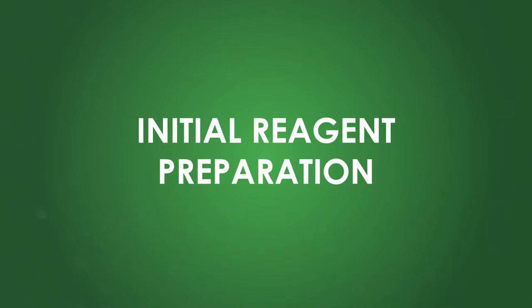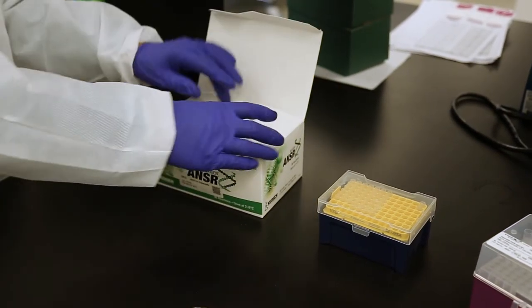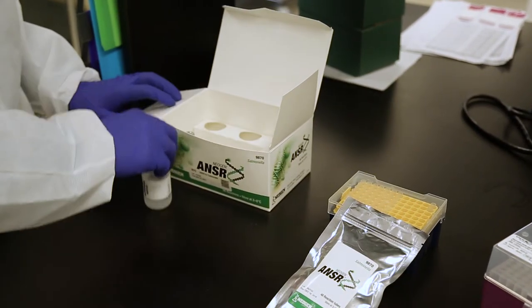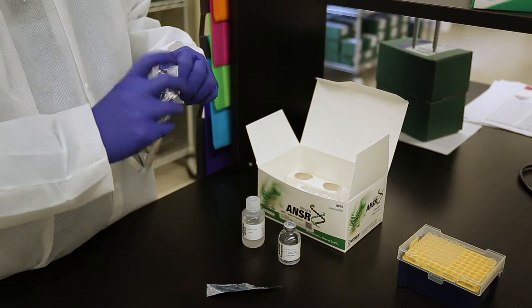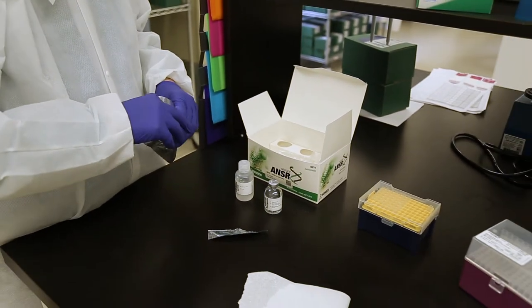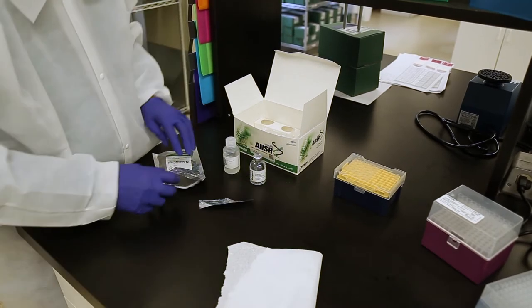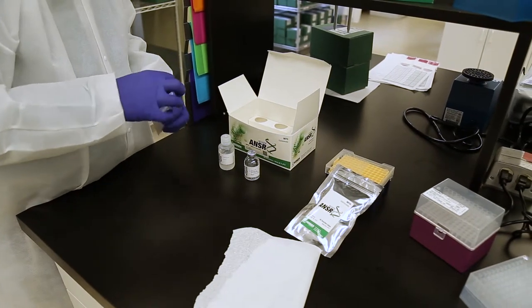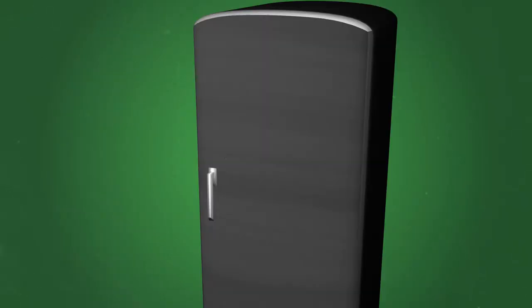Initial Reagent Preparation. Prior to running the kit, the lyophilized lysis reagent, lysis reagent suspension buffer, and appropriate number of reaction tubes for the number of samples you're running need to rest at room temperature for at least 15 minutes. We are running eight samples today, so we've removed one strip from a foil pouch and placed it under a paper towel to protect the samples from excessive light exposure. You should also place one set of permanent caps under the paper towel at this time. Unused supplies should be returned to refrigeration immediately.